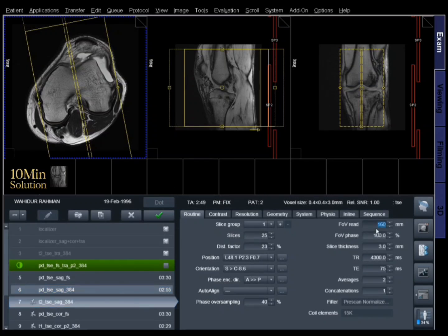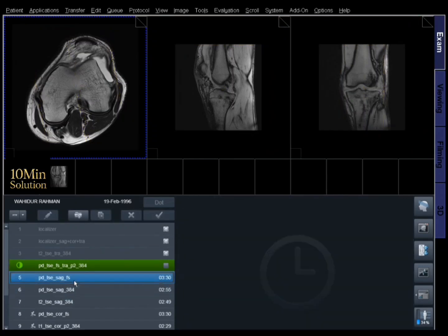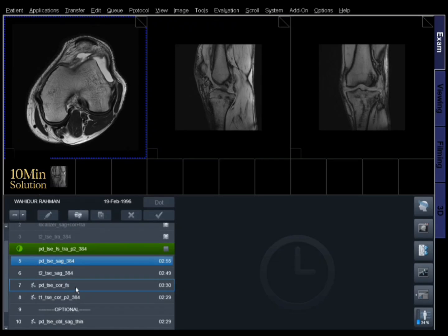Overall, MRI of the left knee plays a crucial role in diagnosing traumatic injuries, chronic knee pain, swelling, mechanical symptoms, and joint instability.